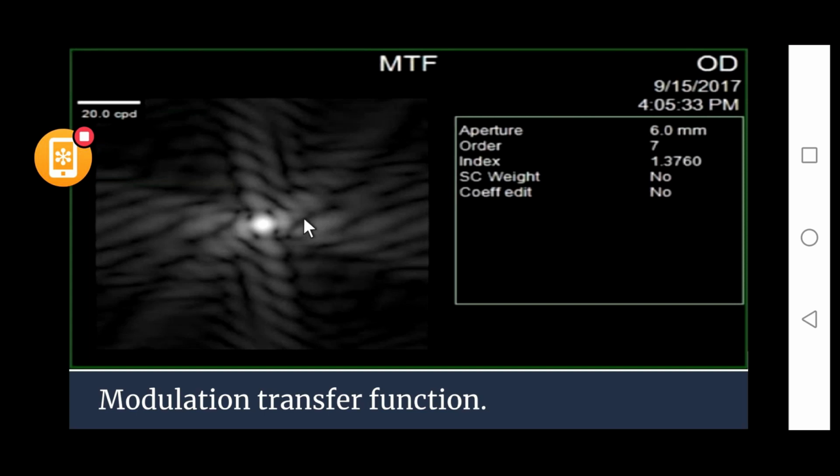Now suppose a 4 candela bulb is lit outside the cornea, in front of the eye. Does it let 4 candela pass through it, or is it letting only 3 candelas pass through it due to the structure of the cornea? So this MTF basically tells you how much of the light intensity is being passed through the cornea, or through the specific anterior surface of the cornea.